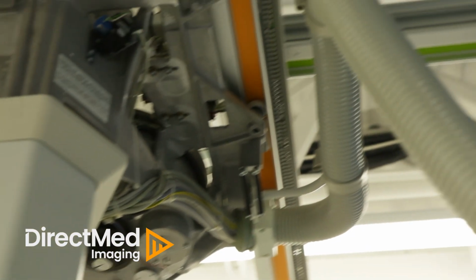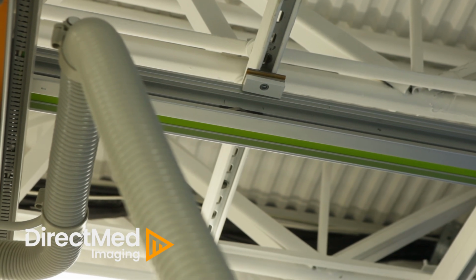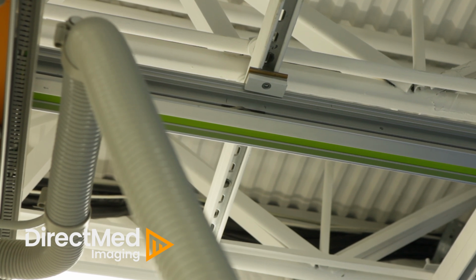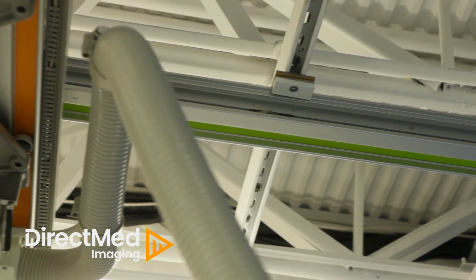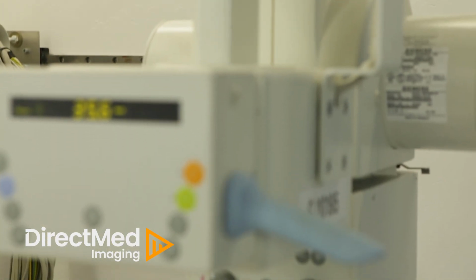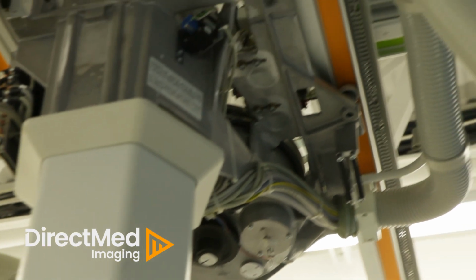This is one of the brackets for the park position. You have one on the transverse and one on the longitudinal side. Basically switches right on the overhead tube assembly, and when it toggles on that bracket, it knows it's in park. So it's very important that when you choose the park position, you choose it to a place where the table will not interfere with the overhead tube. The only way the table knows where the overhead tube is, is by those two brackets.